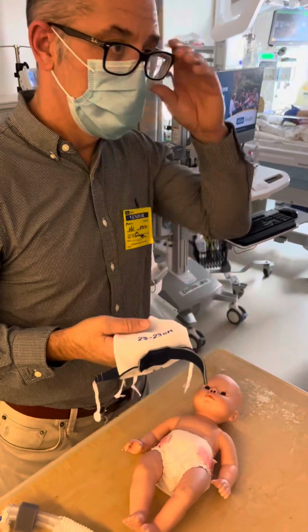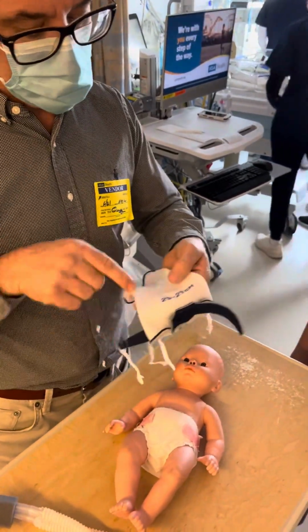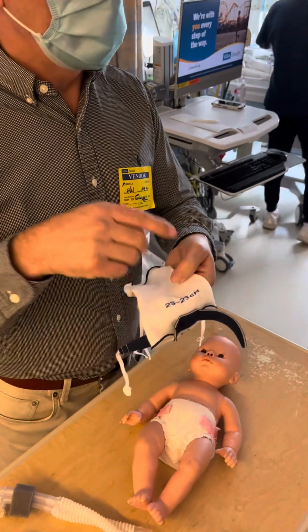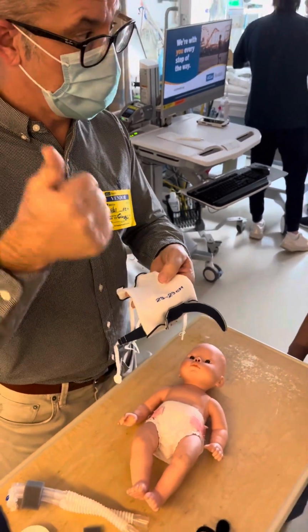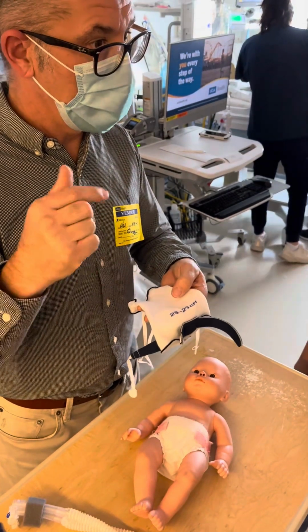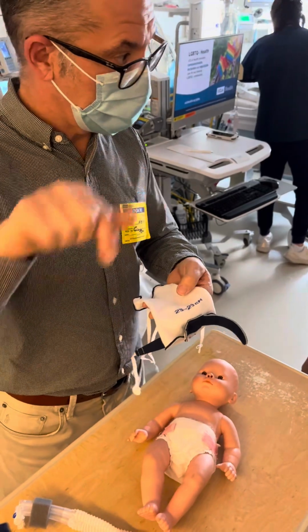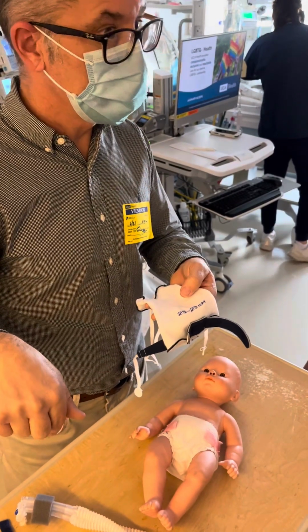So this baby has a 27 centimeter head. This bonnet says 25 to 29. Now there are overlapping sizes. 22, 25, and 29 are on two different bonnets. If you ever have a baby that is on an overlapping size, go to the smaller bonnet. Go to the smaller one.